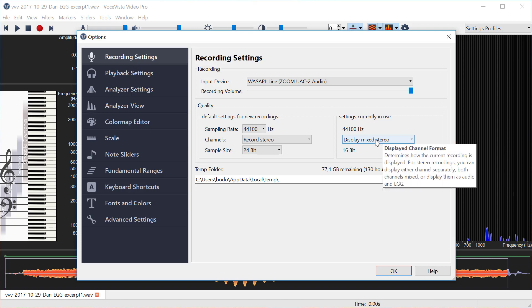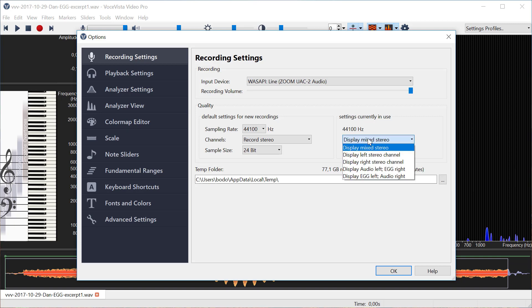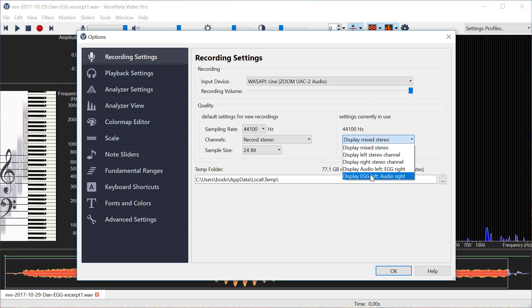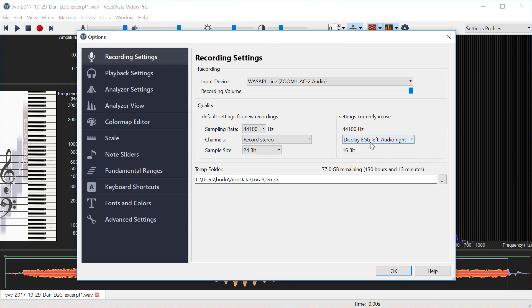That means the EGG channel and the audio channel will be mixed together, and if we do actually have EGG data then we want to see it separately. So I'm going to say here EGG left and audio right because that's how this file was recorded.